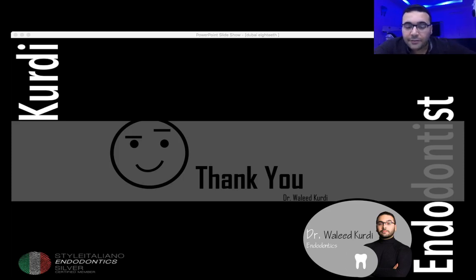Someone is asking me here, if we bypass the broken file and do not have a microscope, is there any technique that helps us in retrieval of these files? All right. You can just try, as I told you, the Endosharp with the smaller size K file, and try to vibrate the broken file. But I have to tell you that you may take the file out or may push it deeper.